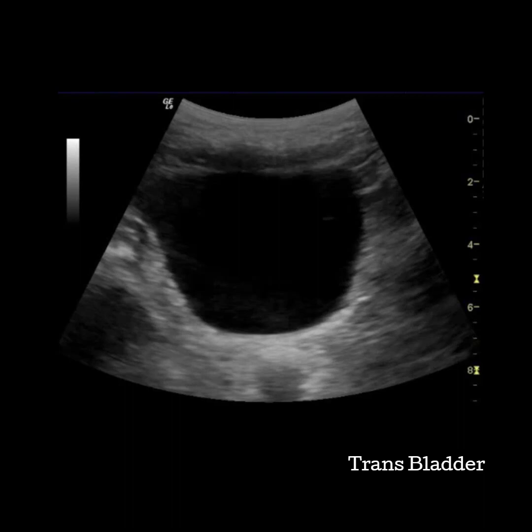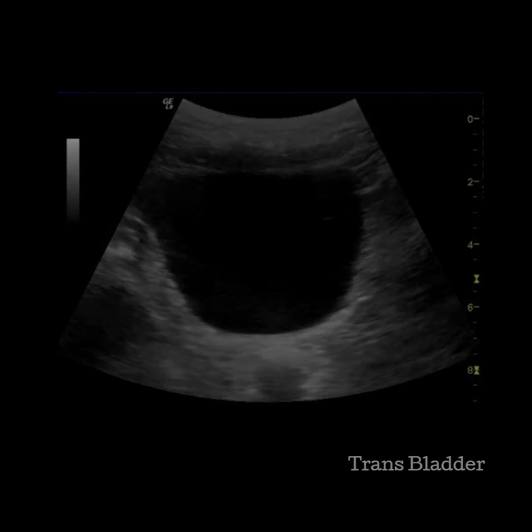Imaging the bladder is usually pretty quick. Make sure to sweep all the way through the bladder to see all the corners and evaluate all the walls. Finding the bladder in transverse is usually the easiest when beginning. Have your patient unbutton their pants and move them down just a bit. Use the towel to position the top of the pants to the top of the pubic hairline. With your notch to the patient's right, sweep down looking for a fluid-filled sac.